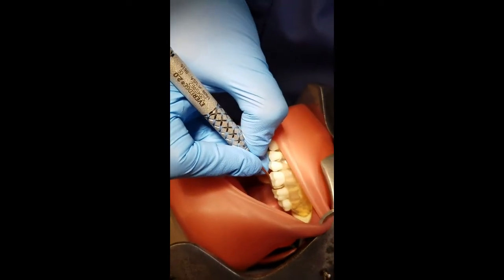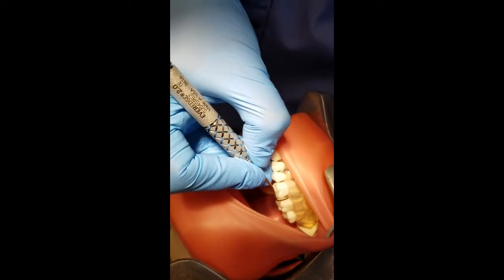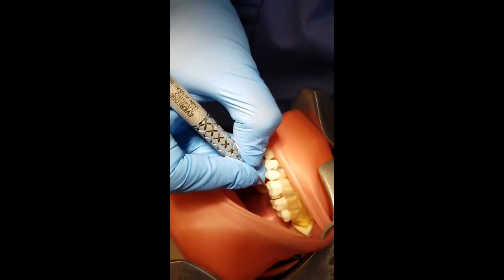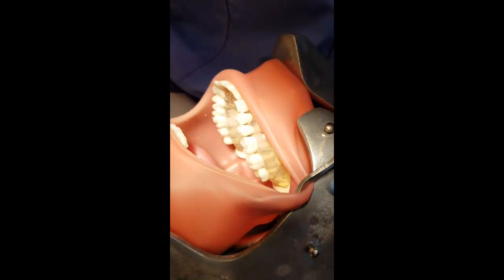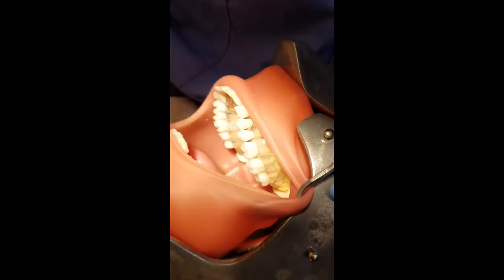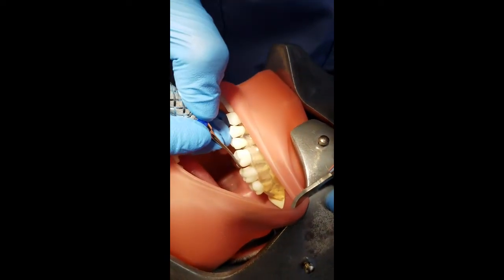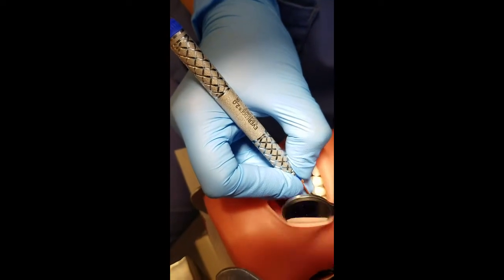We use the terminal shank as a visual clue to determine the correct working end of the instrument. The terminal shank should be parallel with the long axis of the tooth. This is the correct way, and this is the incorrect way. When using the instrument, a modified pen grasp should always be used, with a C shape created between your thumb and index finger.